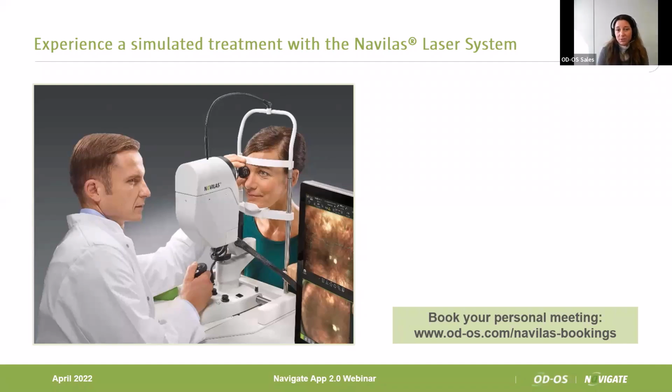If you would like to see more about that, we're happy to show you such a simulated treatment with the Navilas laser system. We have an online booking calendar on our website, so you can easily reserve your personal meeting spot by just selecting a time in this calendar.